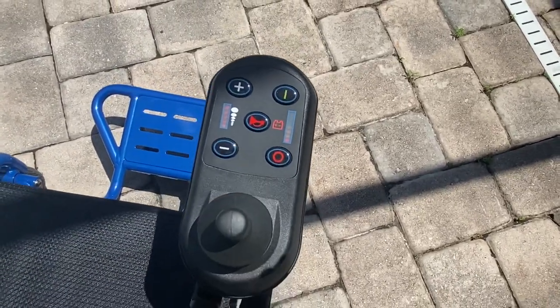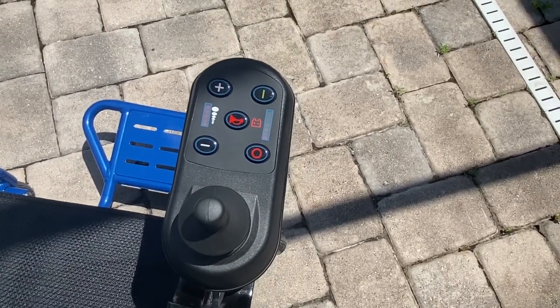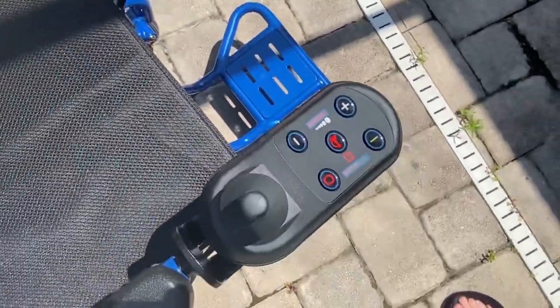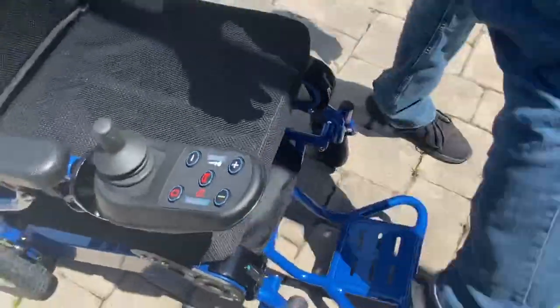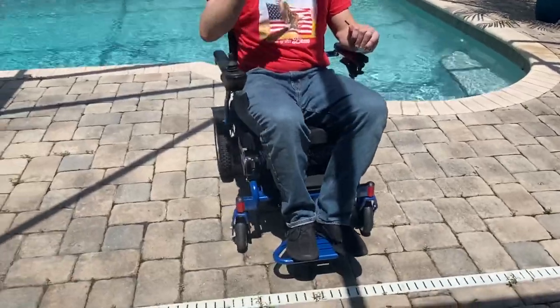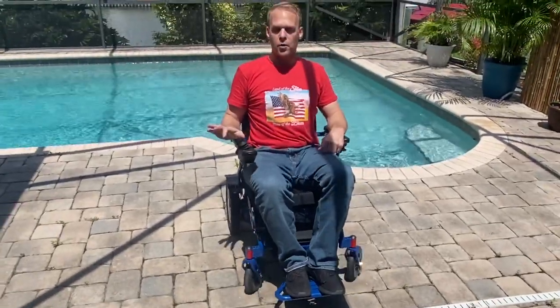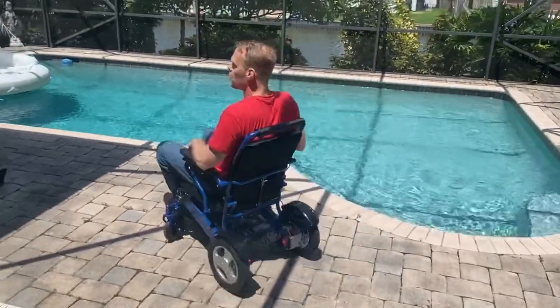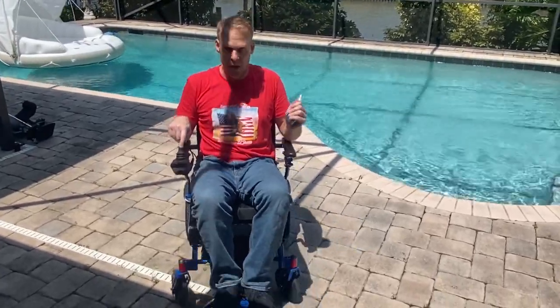The joystick is a Sensi Touch joystick. One of the beautiful things about the Sensi Touch is — if we take the camera back a little and look at the turning radius of the chair — with just one finger it's so easy to turn this chair around. It's very important for me to have a chair with a very tight turning radius that's easy to use, like this chair is.